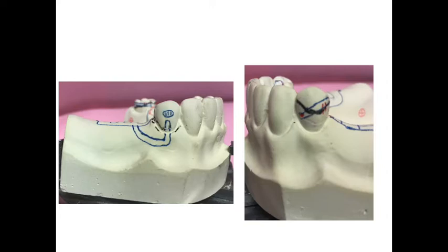And here, I can see my survey line on tooth number 21 is very close to my clasp. My clasp is still above, but it's too close. So ideally, I still want to do some modification. That's why I still mark 2 lines here. Remember, divide it into thirds. The terminal third is under the survey line, the other 2 should be above.